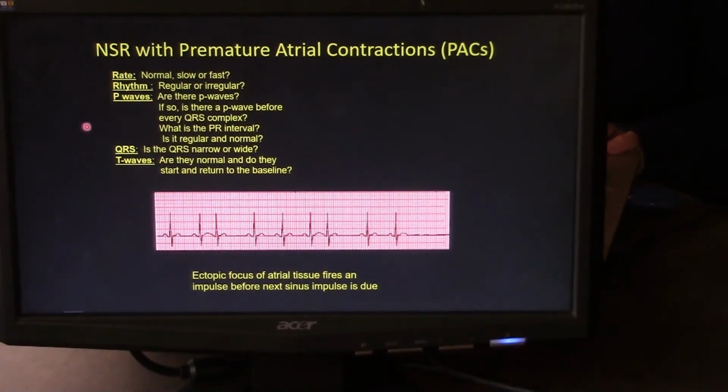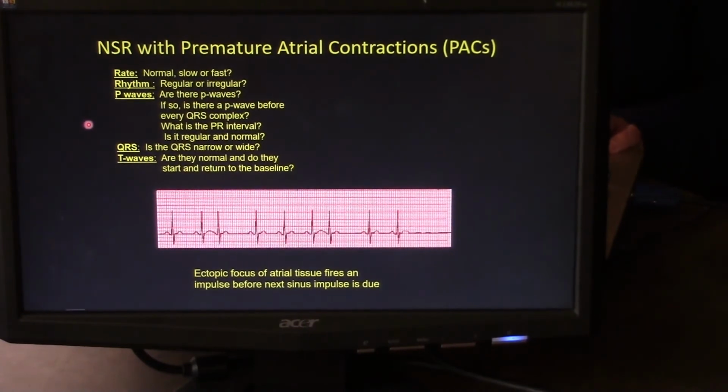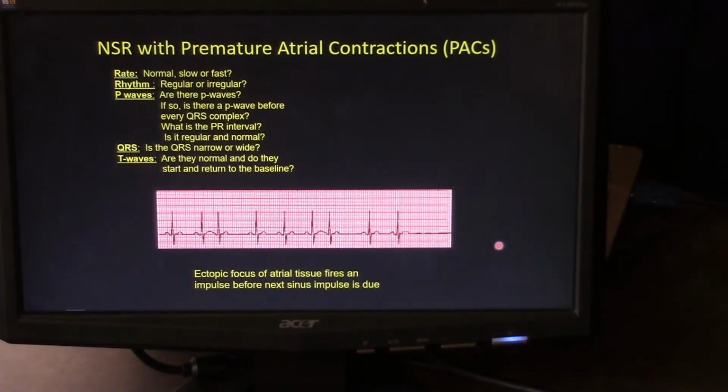Just as we talked about interpreting EKG rhythms using an algorithm that I showed you in the previous slides, I want you to always remember these special points. First of all, the treatment of any dysrhythmia depends upon the patient's clinical signs, symptoms, and level of stability. Another extremely important thing to remember is always check your patient first. This includes checking your ABCs, your vital signs, your EKG rhythms, and any unusual signs and symptoms such as dizziness, chest pain, shortness of breath, or just not feeling right.